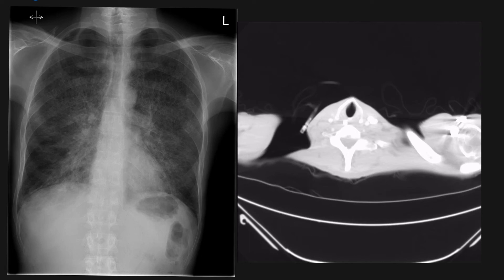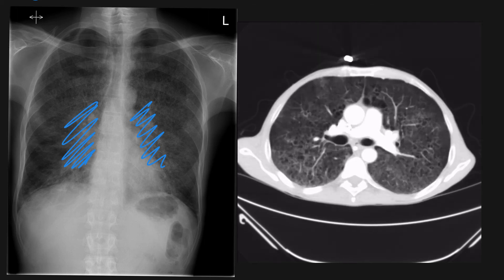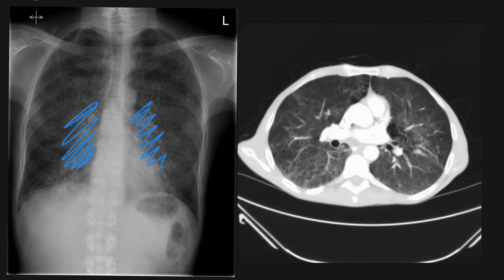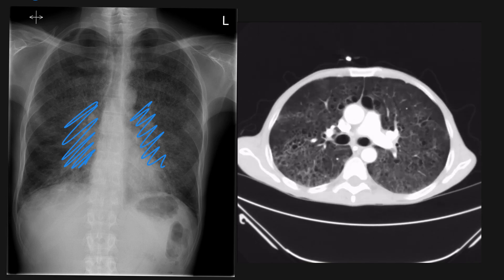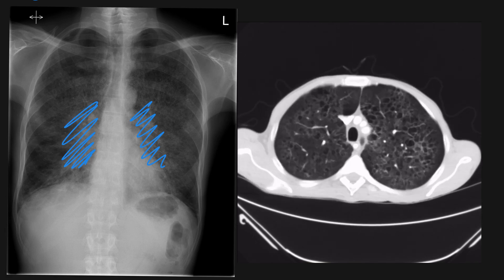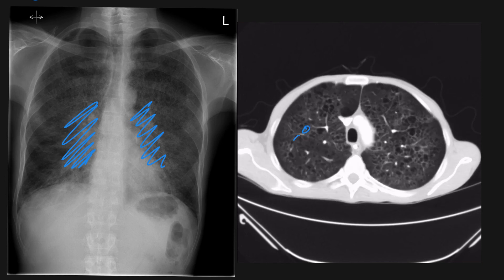This third patient is a 42-year-old male who suffers with HIV and presents with two weeks of shortness of breath. You can see his chest x-ray is quite abnormal, with bilateral reticular nodular opacifications particularly in a perihilar distribution. If we look at his CT, you can see ground glass change in both lungs in a more central location, sparing the peripheries. And if we go to the upper lobes, we can see that there are multiple cysts — these are pneumatoceles, which are seen particularly in the upper lobes in PCP.